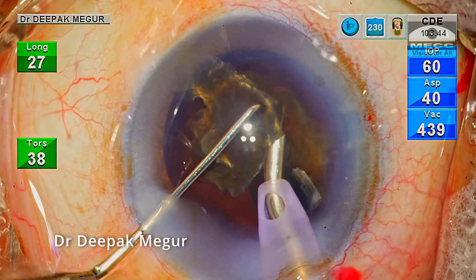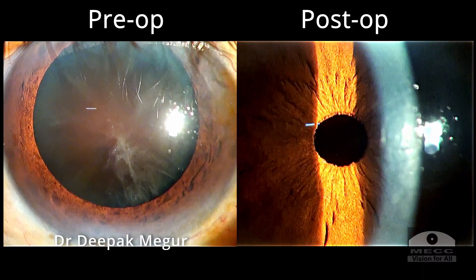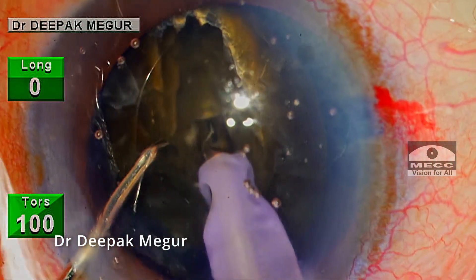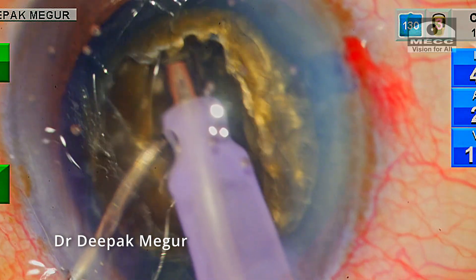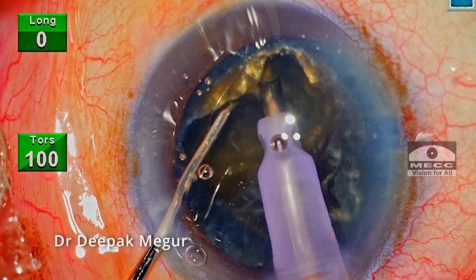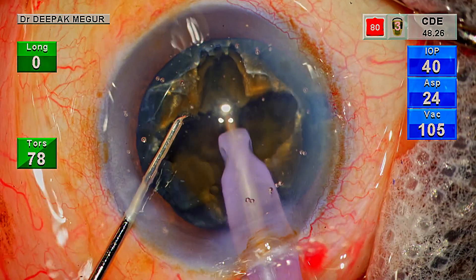To summarize, with this case we can learn that if we are able to minimize lens chatter and turbulence, then a clear cornea on the first post-op day is very much possible even in the hardest of cataracts. Higher amount of phaco energy used during surgery is not directly proportional to endothelial damage; more importantly, at what plane and how far from the cornea this energy was delivered determines the amount of endothelial damage. Torsional ultrasound helps in mitigating wound burn significantly compared to traditional longitudinal ultrasound. To conclude, the traditional four-quadrant technique along with torsional ultrasound works wonders while managing these ultra-hard cataracts.